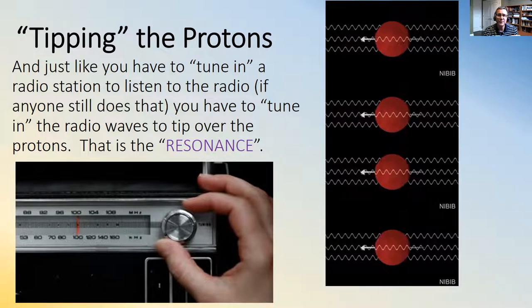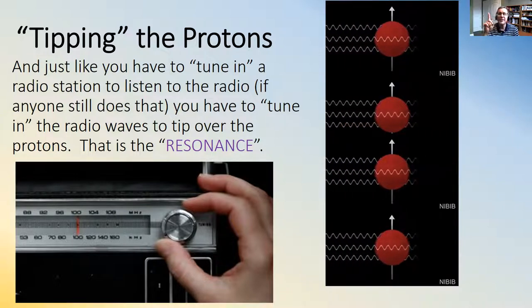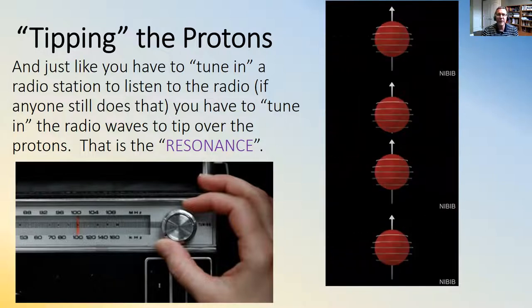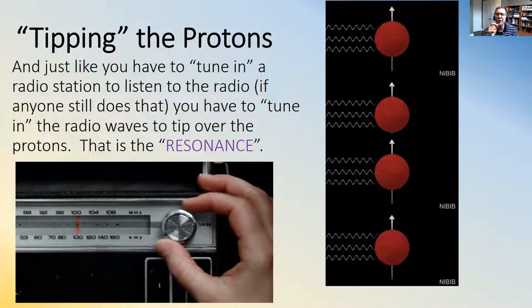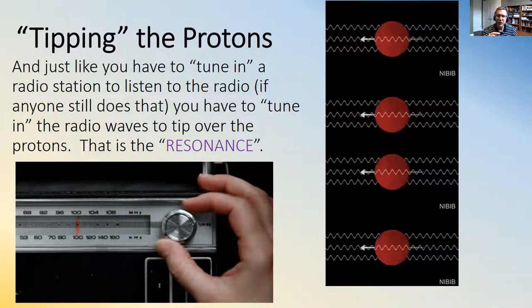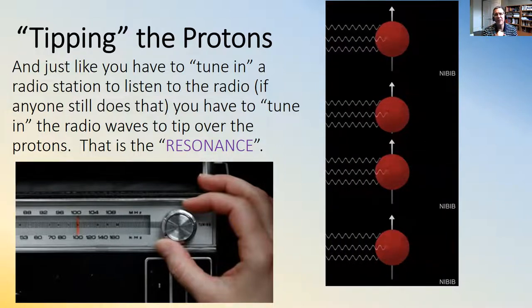That's the resonance. So just like you have to tune in a radio to those waves, to get these protons to tip over, you can't just beam any random radio waves. It's a very, very, very specific frequency of radio waves. And when you do that, at just that magic frequency, the protons say, aha, I feel that, and then they tip over. So that's the resonance.